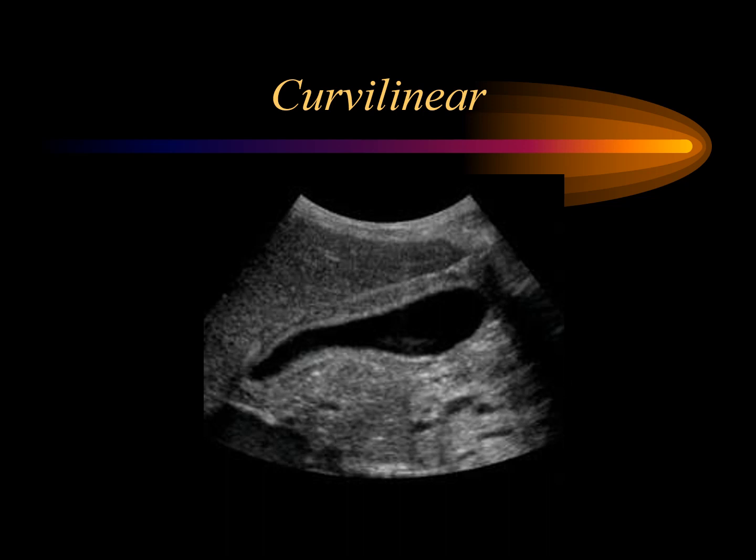Again, these probes typically operate at a lower frequency, which gives us great penetration to image those deeper structures, but with that we lose resolution as opposed to using something like a linear probe.